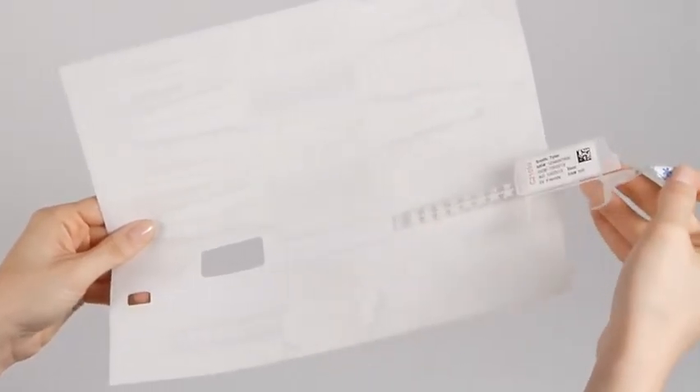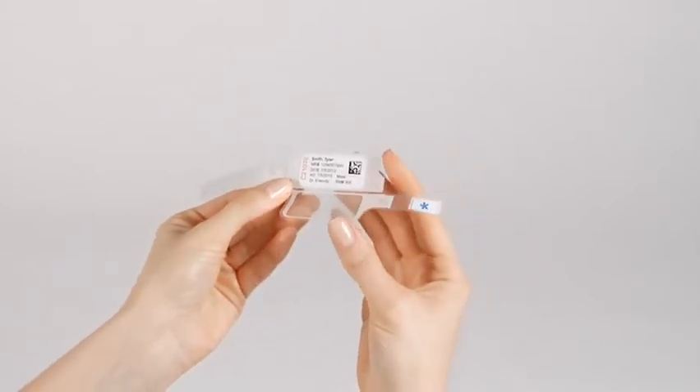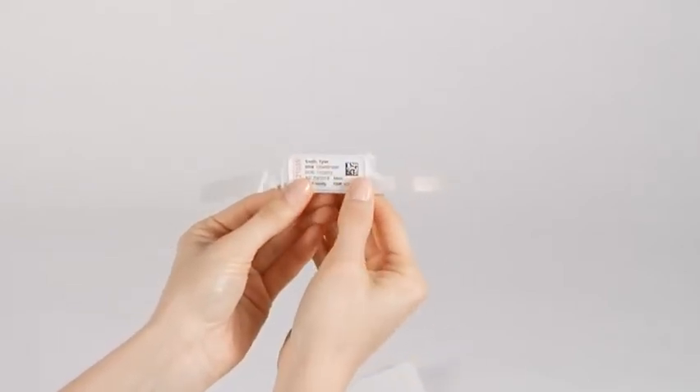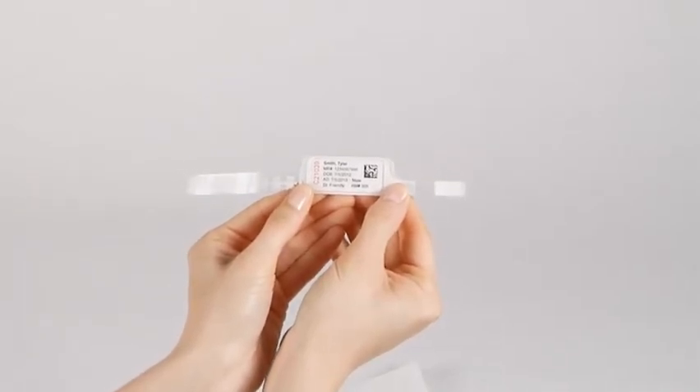Now, pinch the band between your thumb and forefinger along the perforated area between the image area and the laminate window area. From this pinch point, press and smooth the lamination over the image area, creating the patented self-laminating water, alcohol, and solvent-resistant seal on the wristband.